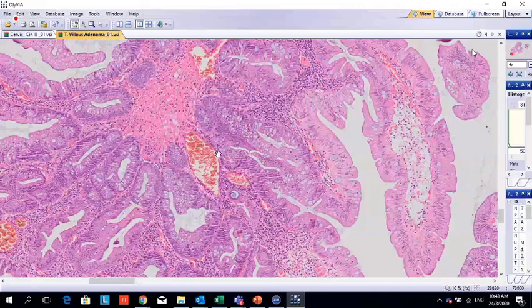Sometimes people have one polyp with an invasive tumor. In this case it is adenocarcinoma in a background of adenomatous polyposis coli. We cannot say just tubular adenoma, because he already has cancer. We say adenocarcinoma in a background of adenomatous polyposis coli. Okay? Understood? Yes.